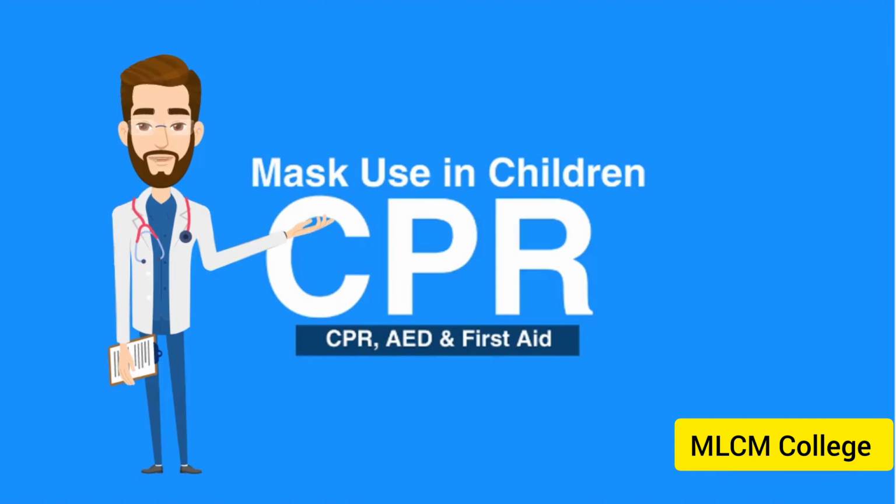Part 36, Mask Use in Children. Welcome to the lesson on mask use in children. In this video, we will discuss the steps of mask use in children.